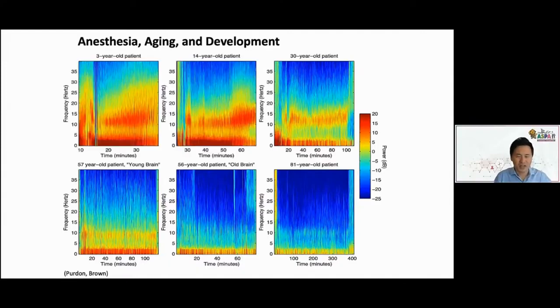So in the younger children, we see the opposite pattern. The very large EEG oscillations get a bit smaller through teenage years and certainly into adulthood. I'll mention one other thing here about the pediatric alpha wave. We're going to be talking about that a lot. There's a paper just accepted, in press, in Anesthesia and Analgesia. First author is Jerry Chao, C-H-A-O. I'm on the paper. Rodrigo Gutierrez, again from University of Chile, is also co-first author with Jerry on that one. We found that in the very young patients, less than 1 year of age, the alpha power is indicative of anesthetic requirements. Maybe that's a little bit of a teaser. So keep an eye out for that paper. It'll be coming out later this year.